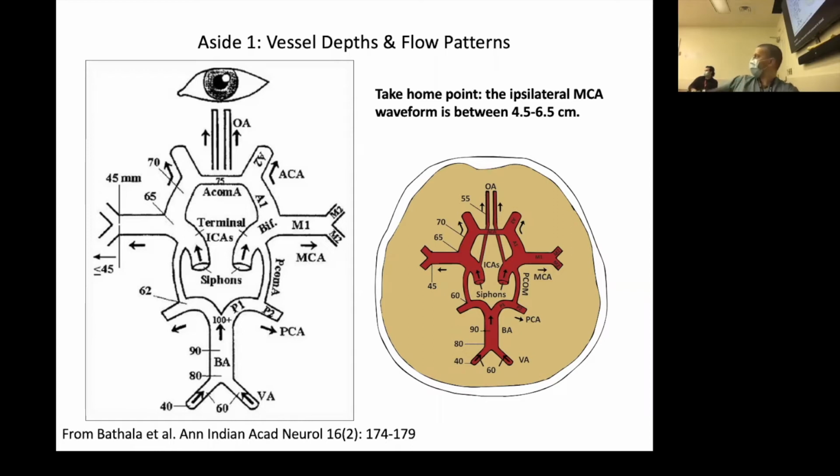Dustin, just a question. Yeah. Do you actually reduce the depth of your, when you said you were showing the contralateral temporal lobe, you may do that initially, but then you reduce your depth just to get a better definition of what's going on? Exactly. Much the same way as with cardiac ultrasound, when you're doing parasternal long axis, you look broadly to see, do I have a pericardial effusion, what's going on? And then you zero in. I zero in to a depth of about 8 centimeters, so I'm trying to cut it right in half so that I can really interrogate that roughly 2 centimeter vessel.